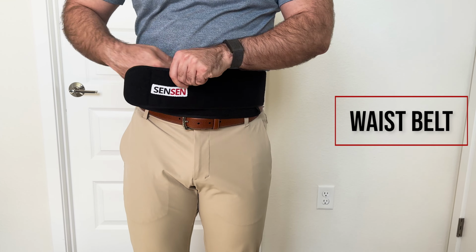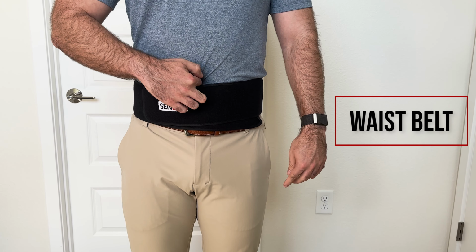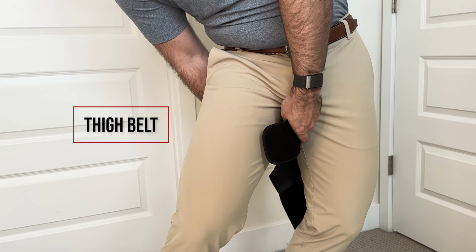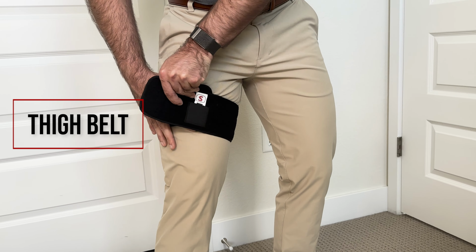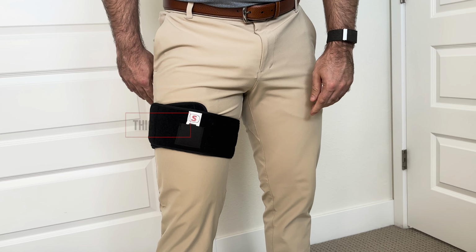The waist belt should be located so that the top of the belt is in line with the client's umbilical and the sensor is centered on the back. The thigh belt should be located so that the sensor is sitting on top of the quadricep between the hip joint and above the knee, and it should be snug enough that it doesn't slide.